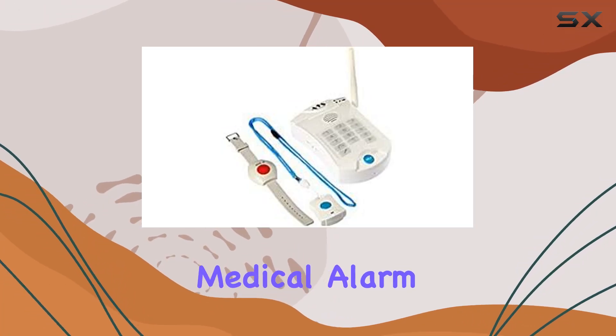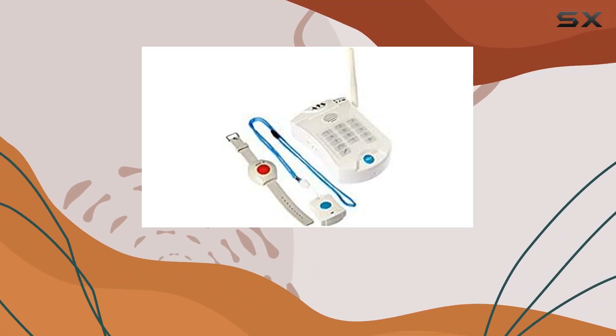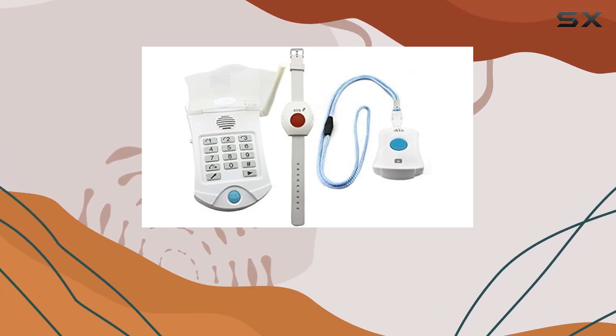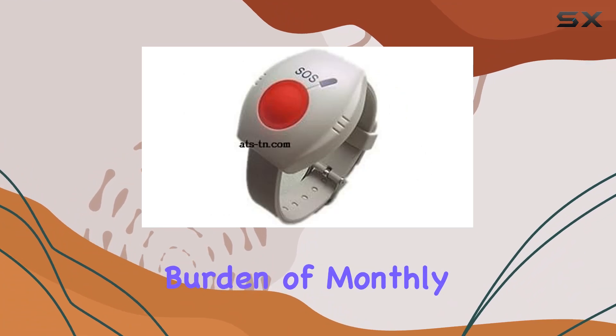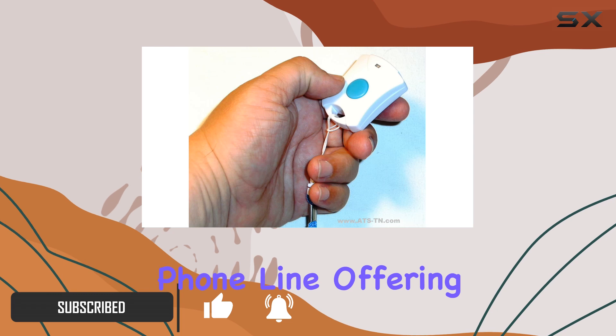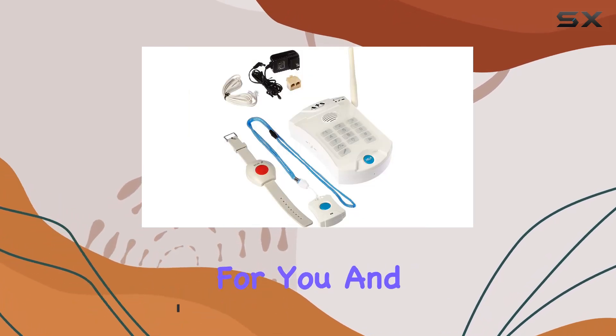The LifeGuardian Medical Alarm HD700 is an exceptional emergency alert phone system designed for those who want reliable protection without the burden of monthly fees. This system is specifically tailored for use with a home phone line, offering peace of mind for you and your loved ones.